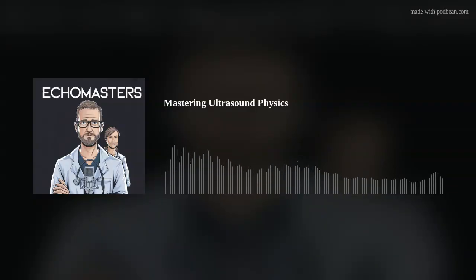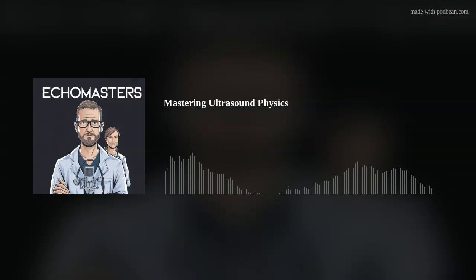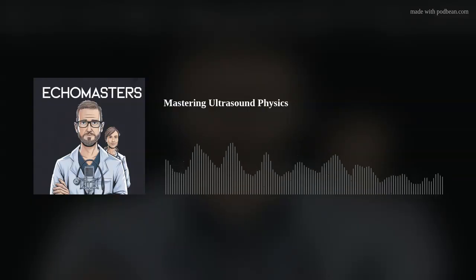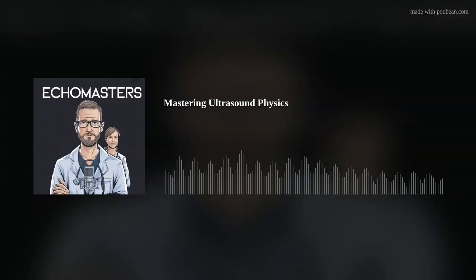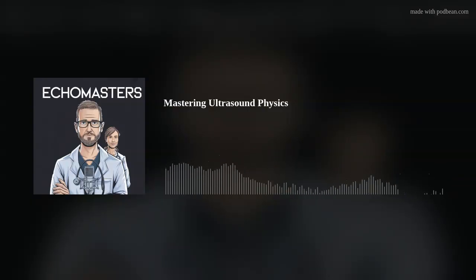So if we pull back and look at the big picture here. Ultrasound's whole journey, right? From those basic A-mode spikes to the incredible 4D stuff we just talked about. It really highlights its enduring importance in medicine. Absolutely indispensable. Think about its advantages. It's non-invasive, no radiation, it gives you real-time images. It's incredibly safe, which is why it's so central to things like obstetrics. Right. But it's used everywhere now. Emergency medicine, cardiology, guiding biopsies. Its versatility is amazing. And the technology just keeps getting better: smaller machines, better image quality, new techniques. It's a cornerstone. It helps doctors literally see the unseen.